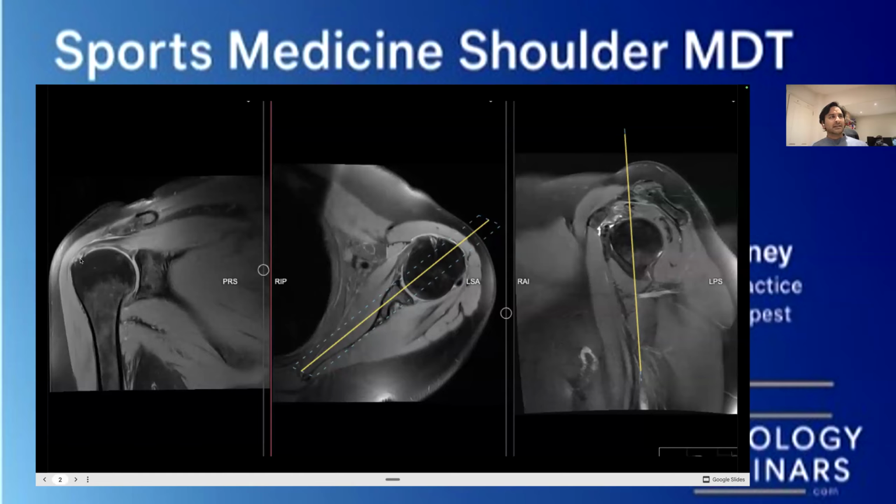It looks like it's got a bit of brightness in it. And we also know that whatever's bright on this image is not going to be fat. It's going to be fluid. So therefore, there must be fluid located within those tendon areas located within that supraspinatus area.